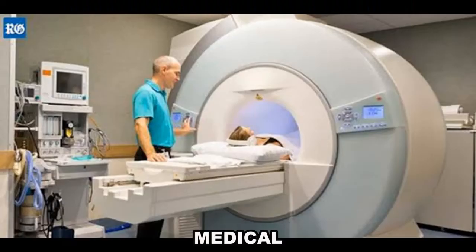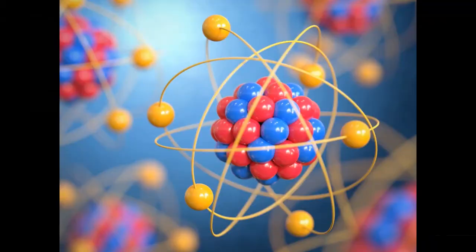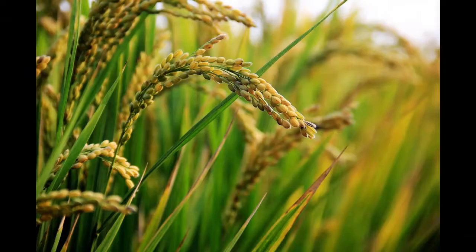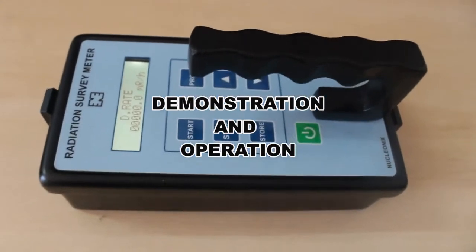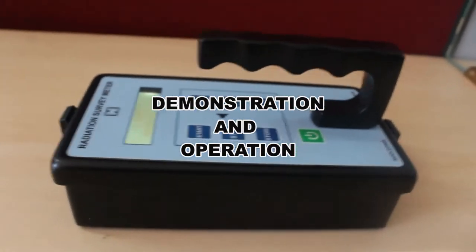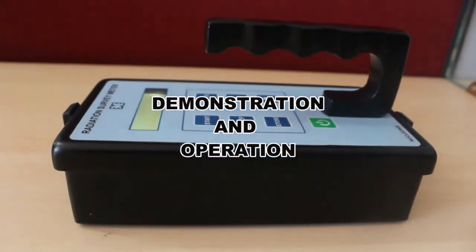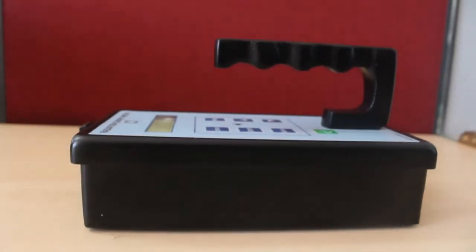Medical and agricultural sectors where radioisotopes are used — for a variety of applications. At this point, we would like to demonstrate the operation and measurement of dose rate using the radiation survey meter.